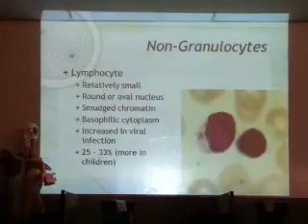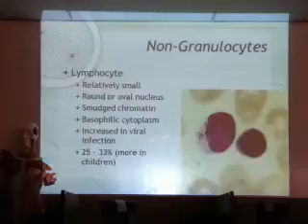Okay. So granulocytes, recap. We've got eosinophils if the granules stain with eosin, so more like orange, purplish, orange-pinkish inclusions, and basophils if the granules stain with methylene blue and you get black, dark purple inclusions, and neutrophils if the granules don't stain that well, but you can see the small granules in the cytoplasm, and it's the most abundant form, neutrophils.